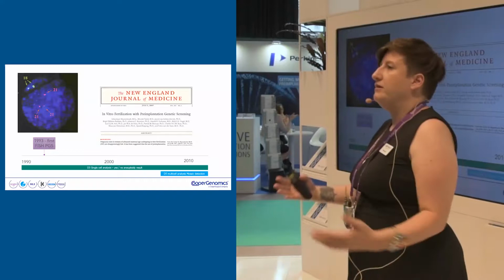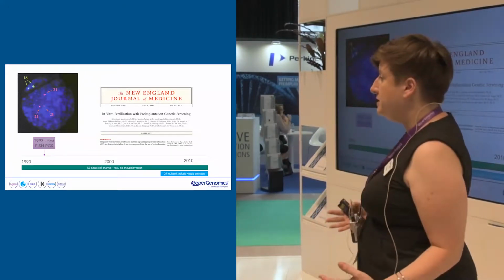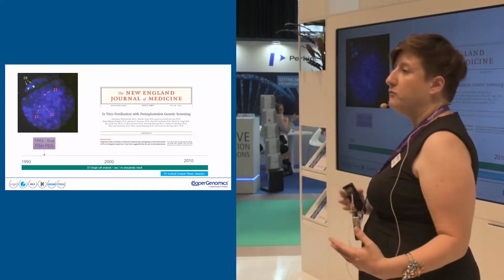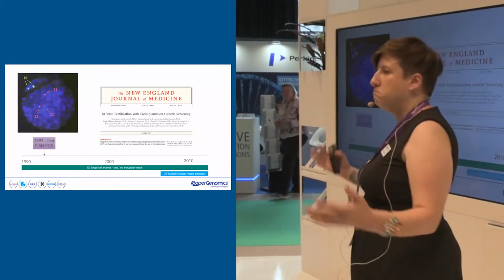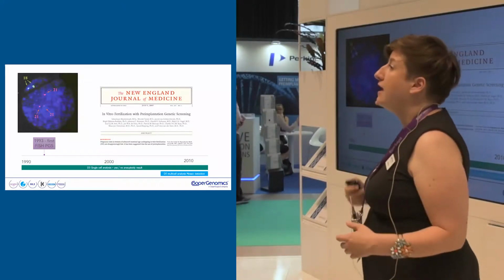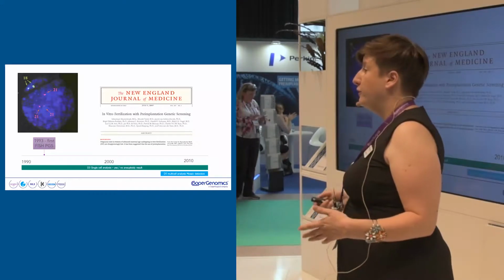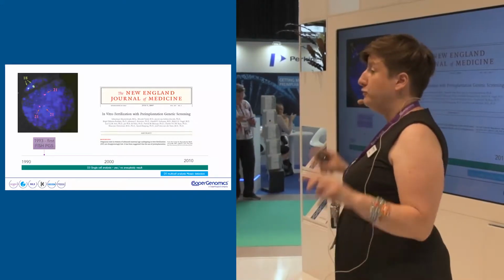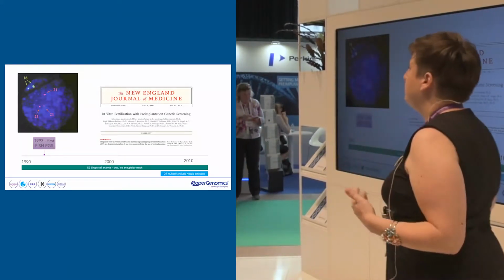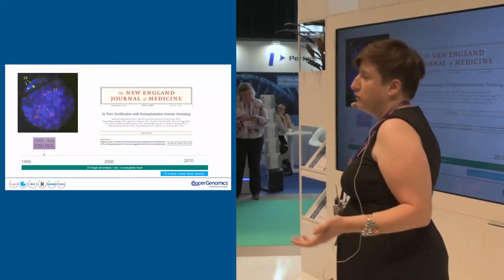And that's one of the main reasons for the talk today, to talk people through the evolution of PGT, because we still come across so many people in practice who say, PGT doesn't work, I've read the papers. It's really just to highlight how what we do today, in what some people are now calling PGT-A 2.0, is completely different to what we were doing over 10 years ago now.